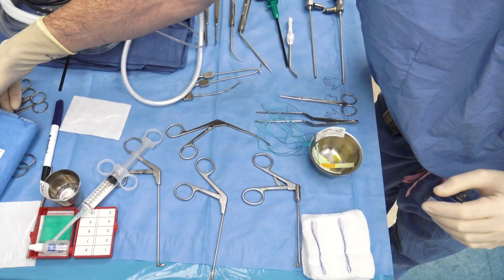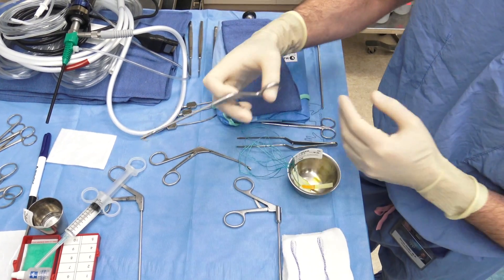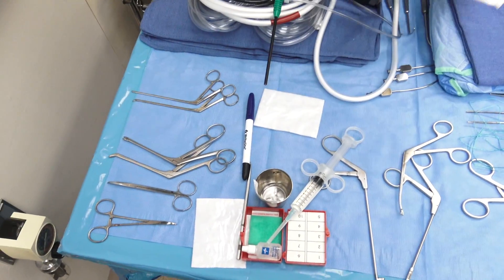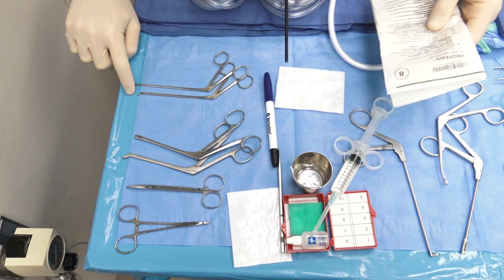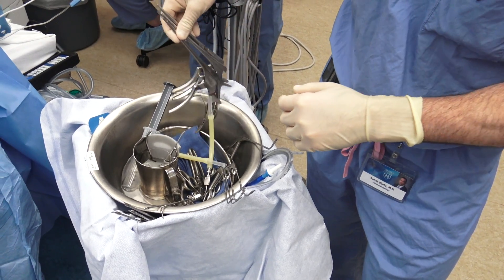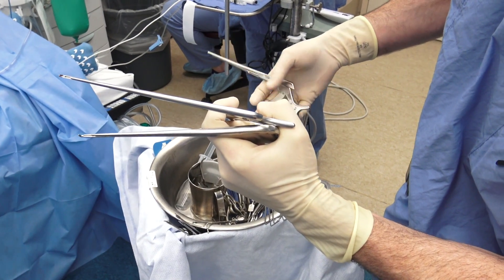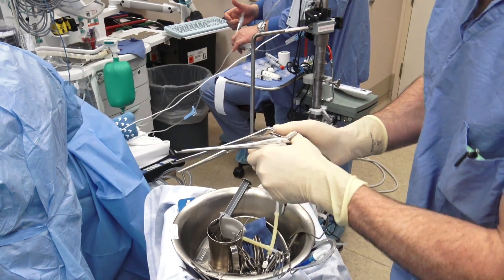A number of other pieces of equipment are here. We've got backbiters — good for the maxillary sinus, biting back on themselves. This is the adult size and this is the pediatric backbiter. These are our Blakeslee grasping forceps, both adult and pediatric sizes, straight and 45 degrees. These are our Kerrison rongeurs. On our sets we typically have a 1mm — very thin — a 2mm up-going Kerrison rongeur with a 45-degree bend on the tip, and a down-going 2mm Kerrison rongeur. Those three Kerrisons are usually on the set.